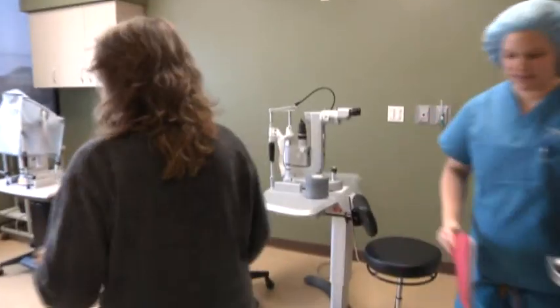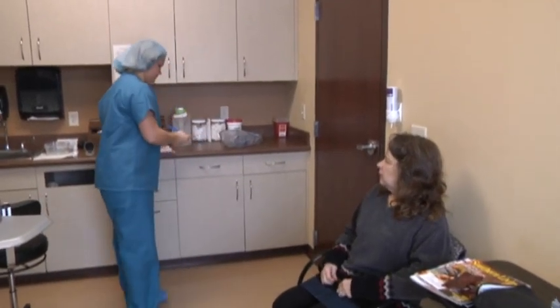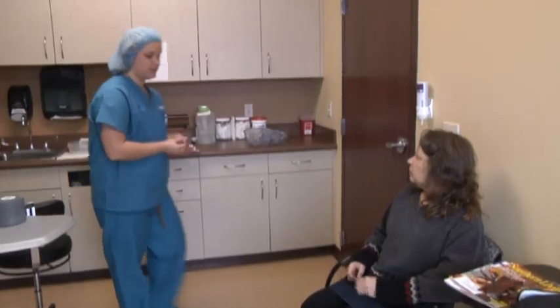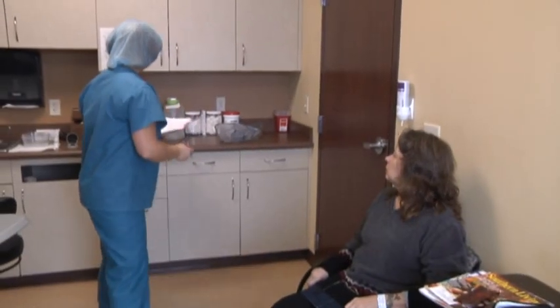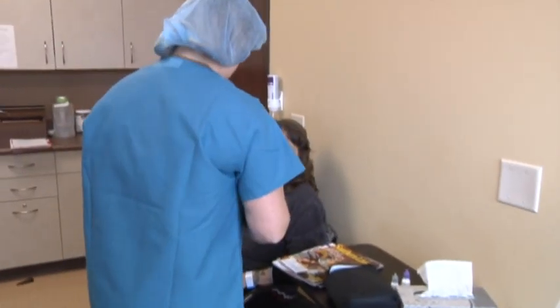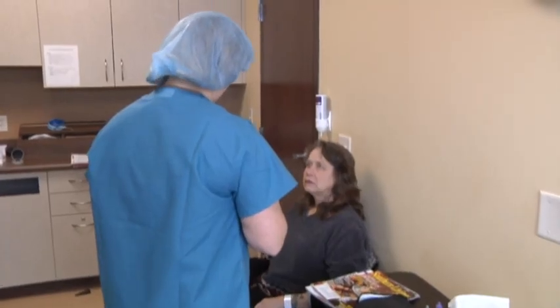Watch and see. Which eye are we working on for you today? Left eye. I'm going to put this on your left wrist. What I'm going to do is get started with some eye drops in that left eye, putting them in a couple minutes apart. They sting for about 30 seconds — just going to numb and dilate that eye.